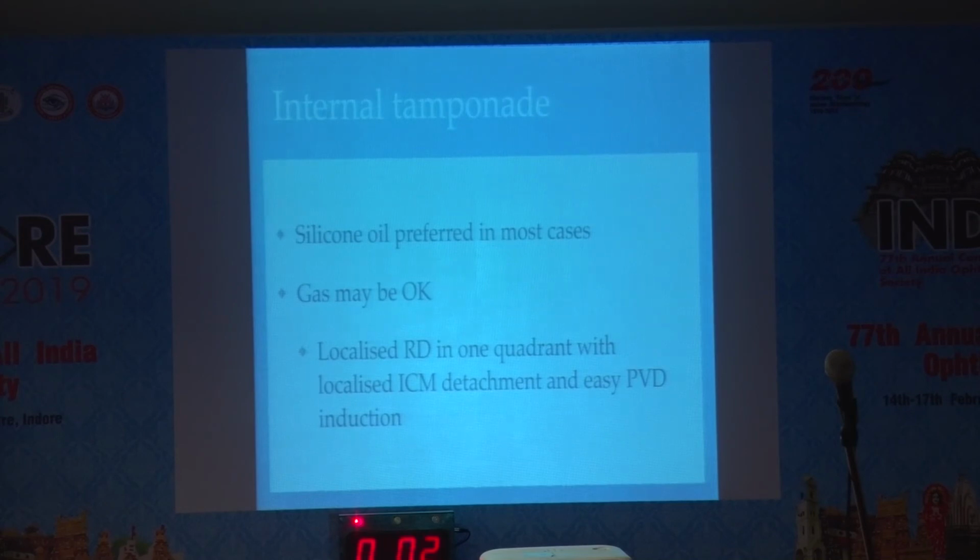Can I go ahead with half a minute more? Yeah. Gas may be okay in selected cases where only a small sector is to be tamponaded.